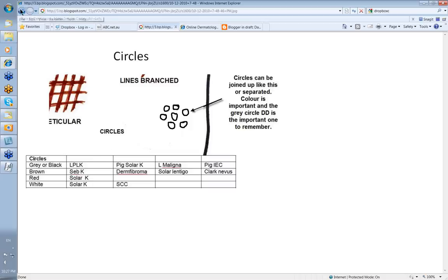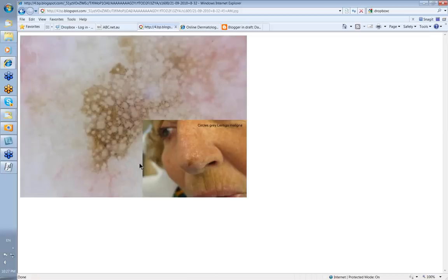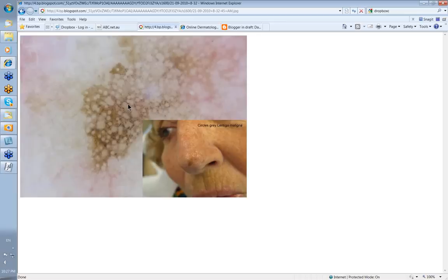Let's first of all have a look at grey or black circles. This is a pigmented lesion on this lady's nose. It's a little bit diffuse and difficult to see, but when you put your dermatoscope on it, you see both dots and circles — that's often the way with grey circles. They're often made up of grey dots. These are the openings of hair follicles, and this is melanin either in melanophages or melanocytes around the hair follicles. This in fact was lentigo maligna.